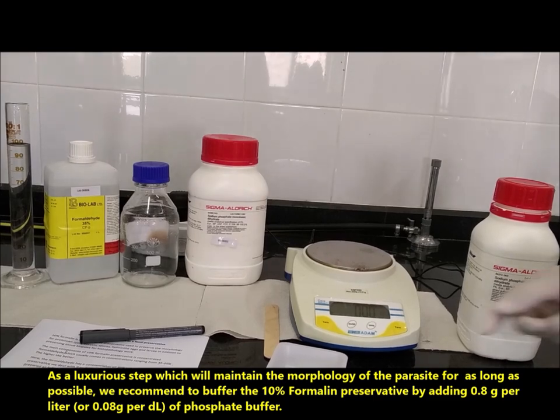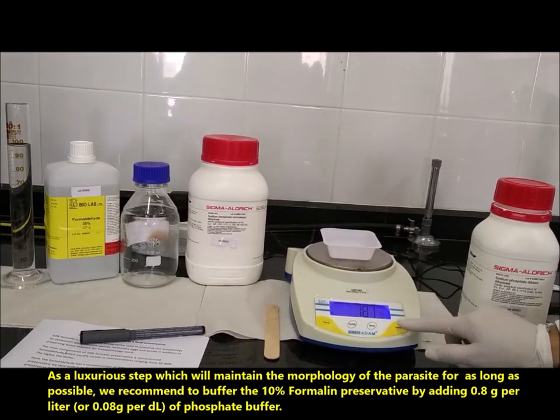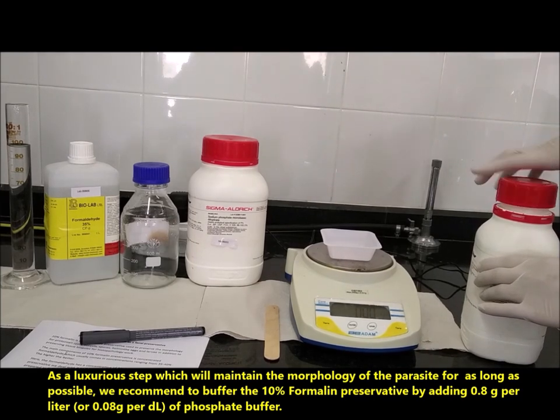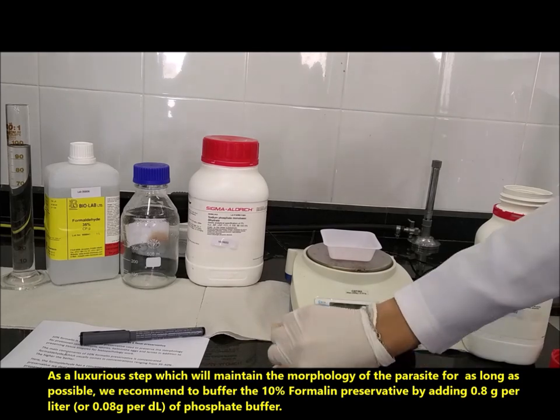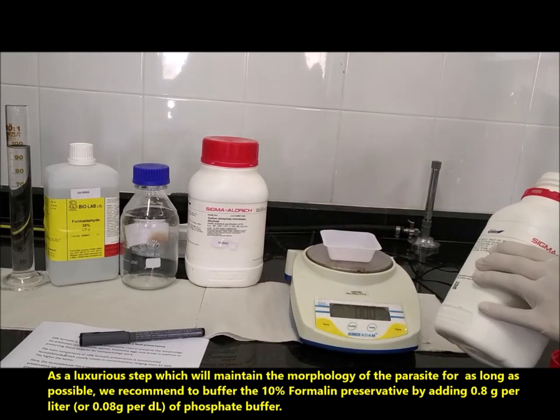As a luxurious step, which will maintain the morphology of the parasite for as long as possible, we recommend buffering the 10% formalin preservative by adding 0.8 g per litre — or 0.08 g per deciliter — of phosphate buffer.